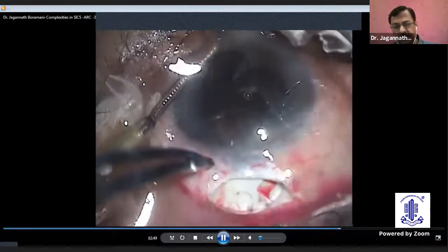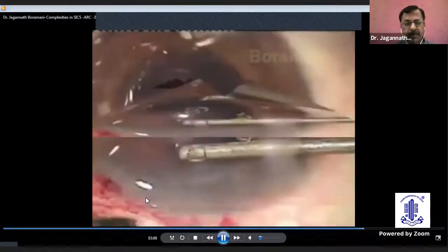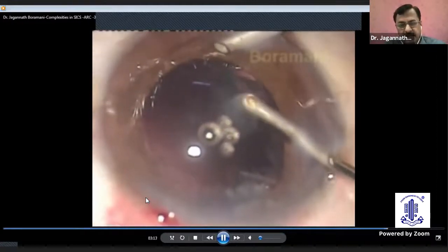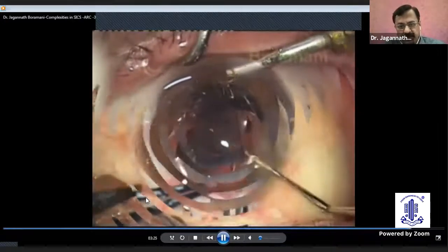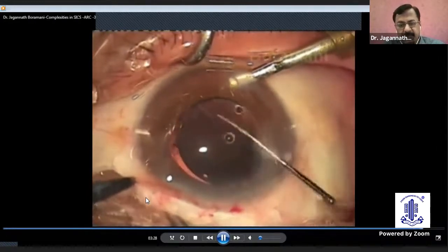The bottle height is also lowered here, and there are no major jerky movements, and this lens is now implanted in the ciliary sulcus. The AC maintainer is now maintaining the atmosphere in the anterior chamber. Here the vitreous has prolapsed — I have done the automated vitrectomy, but I have not stopped the AC maintainer. The AC maintainer is acting as irrigation, but there is no turbulence because the bottle height is lower. Once you do the vitrectomy, you can gently do the aspiration without allowing further vitreous to come into the anterior chamber. With the AC maintainer, many times you can manipulate such cases in spite of a PC tear, and here again a lens — a rigid lens — is implanted in the ciliary sulcus.